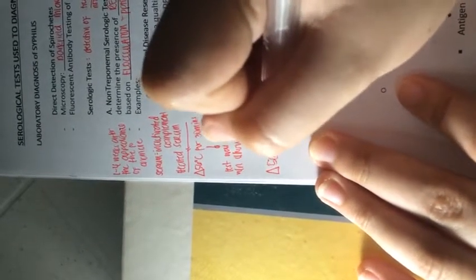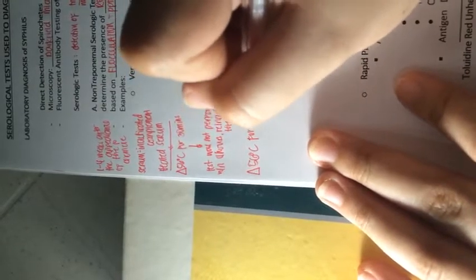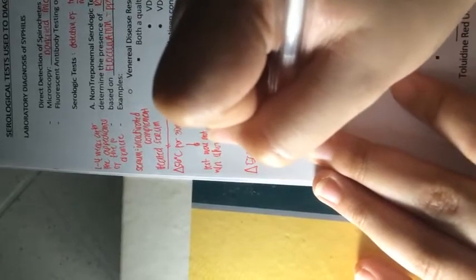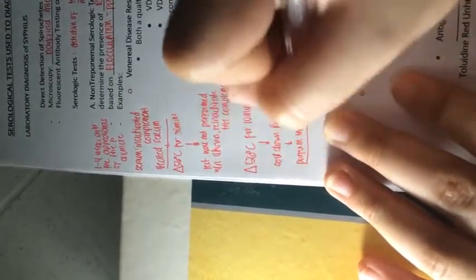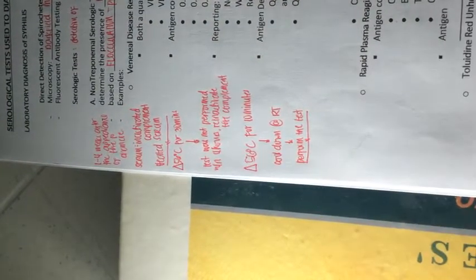We need to reheat our serum at 56 degrees Celsius for 10 minutes, and then cool down at room temperature, then perform the test. 30 minutes to 1 hour would be enough to cool down our serum sample to room temperature. After that, we can now perform non-treponemal serological tests.